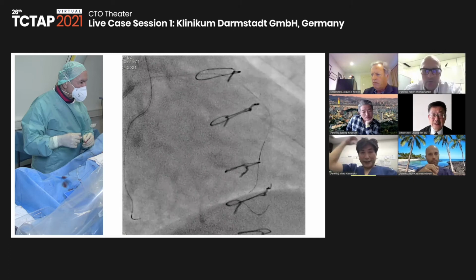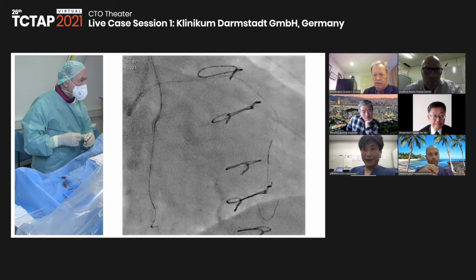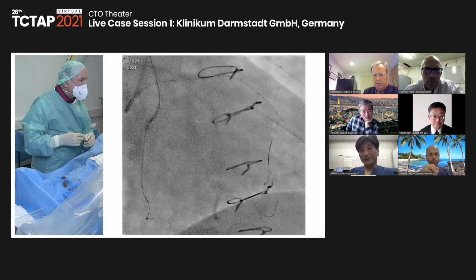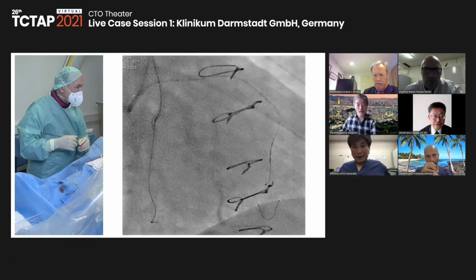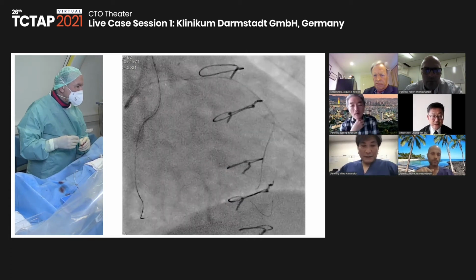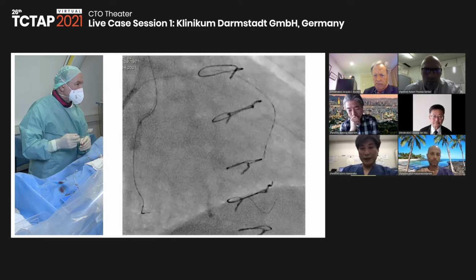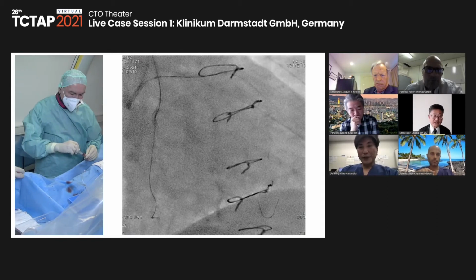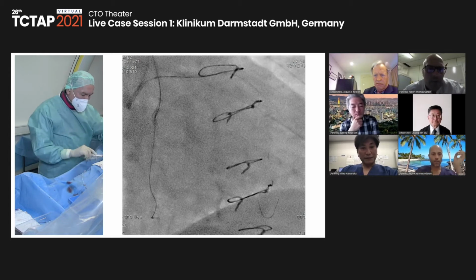So that's right. Almost 70% of the retrograde channel wiring is using the Suo 03. Now they're very popular. You're using more Suo 03 instead of Sion. Why? Because of the safety issue. Safety, even in the septal. Even the septal, yes. Okay, great. Yeah, I fully agree.